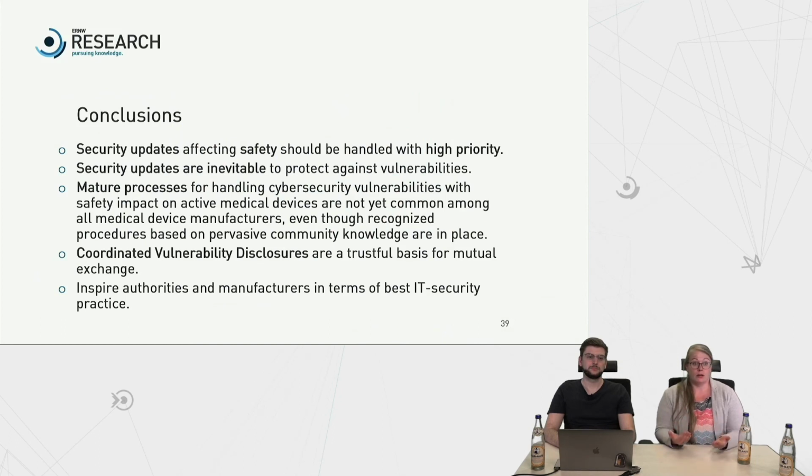So coming to our conclusions. Security updates affecting patient safety should be handled with high priority. All security updates are inevitable to protect against vulnerabilities. So cybersecurity is a continuous process. We have seen also in the whole project that mature processes for handling cybersecurity vulnerabilities with safety impact are not yet common among all medical device manufacturers, although recognized procedures are in place.